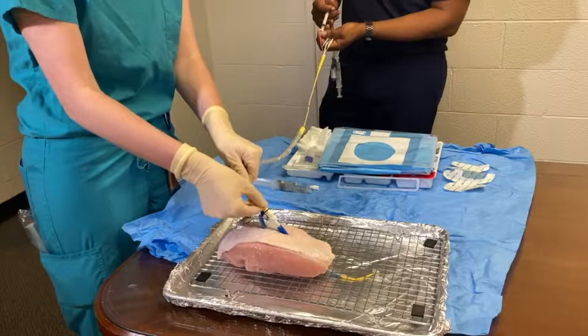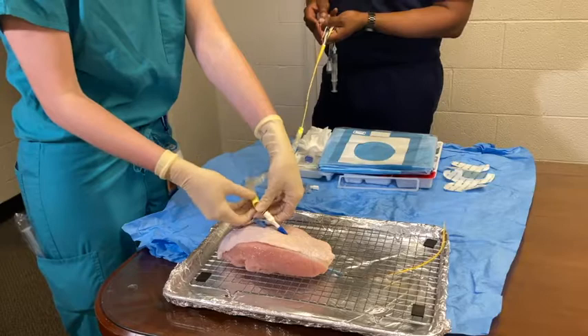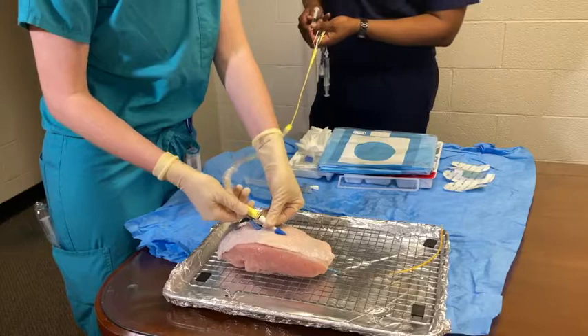You will begin to advance the catheter watching the PA waveform as you go. Think of the balloon as a raft and the blood flow carrying it to its destination. Once the waveform indicates the PA waveform, you will deflate the balloon and lock the PA catheter into place on the MAC introducer.